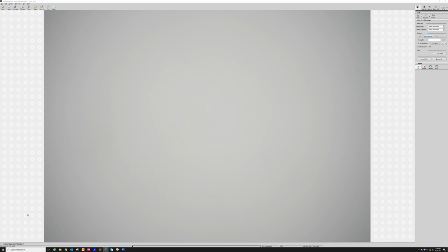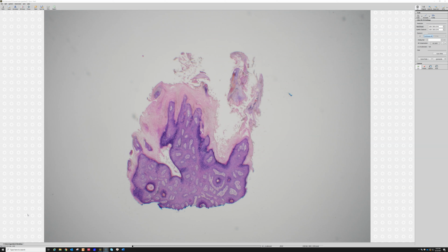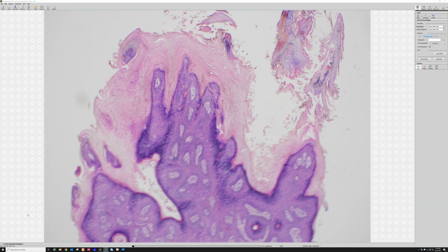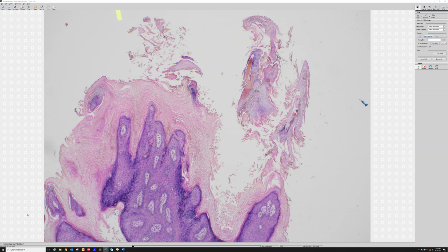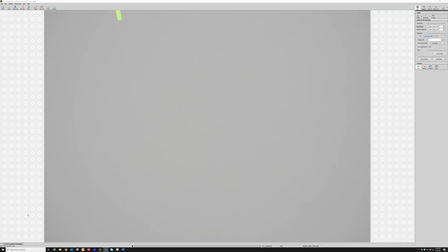All right, and the last three are just to show you that warts don't always have to be this big and dramatic. Sometimes they're just tiny little things. Here's another one of those little ones from the eye that's probably a filiform wart, little tiny thread-like papillae coming out here, and they often just get snipped off with little scissors. And so you may only see a few papillae there, and the hypergranulosis, and then there's some blood and spires of parakeratin up there. It's a little tiny verruca there.